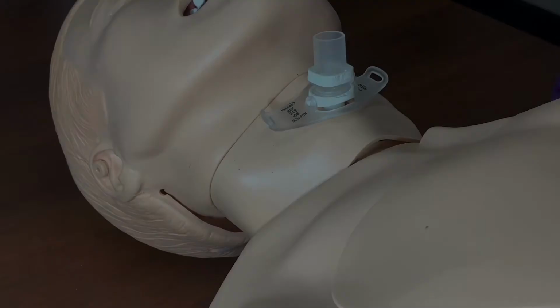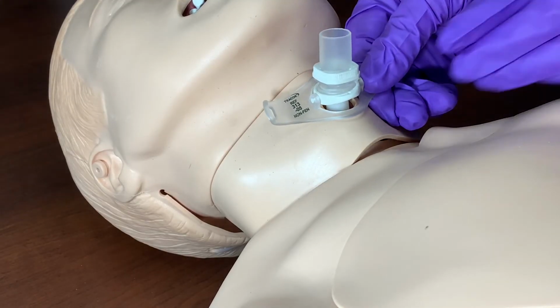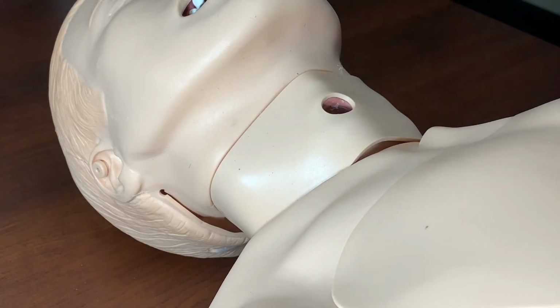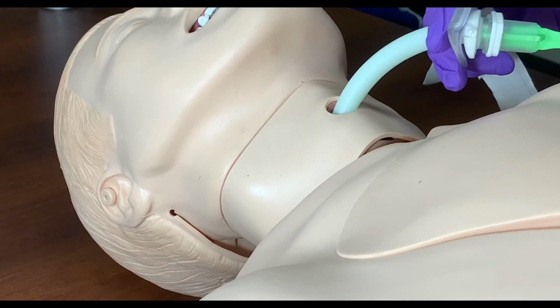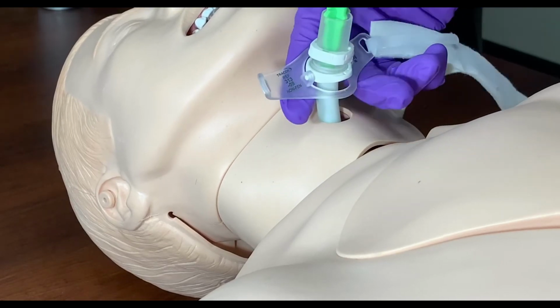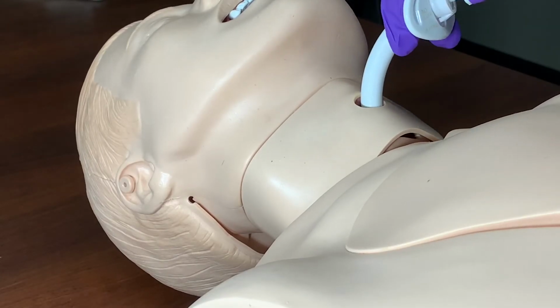When removing the tube, keep in mind that it is curved, so as you pull it out, you will have to pull it down to allow it to exit smoothly. When ready to replace the tube, it is often easiest to start with the tube at a 90-degree angle to the stoma. Place the tip of the tracheostomy tube into the stoma, then rotate your hand as you are pushing in so that the tube flanges are horizontal in line with the neck. Pushing straight in will not usually be effective as the tube is curved.